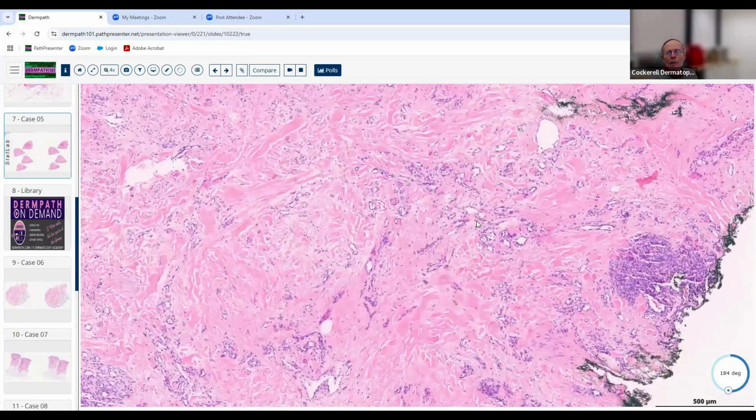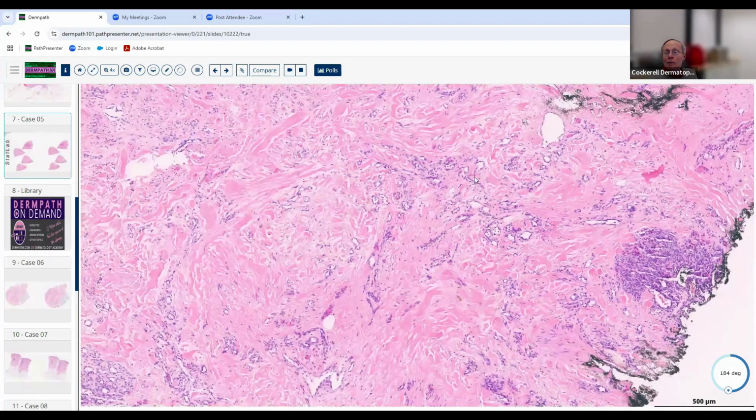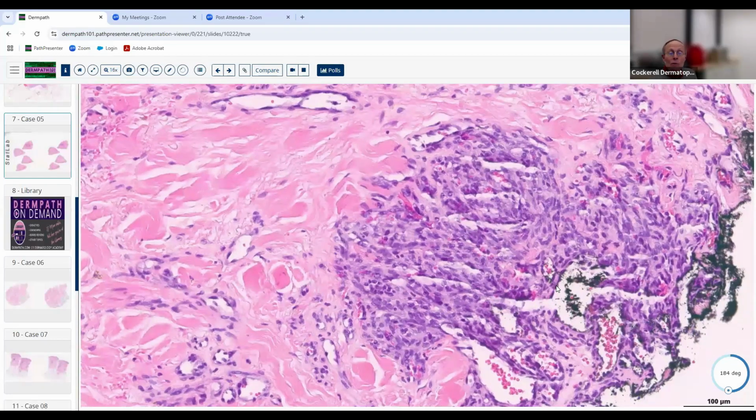It's a pseudosarcoma. I mean, it does have some histologic features that if you just looked at it in isolation, you might get kind of concerned about it. A lot of these blood vessels are somewhat irregular. They've got some slightly large endothelial cells. Don't see any mitotic figures. You've got this little sort of vascular tuft. We see that sort of tuft-like vascular proliferation sometimes in things like Kaposi sarcoma and whatnot. So when pathologists look at this, they start getting worried about it. But you need to understand this is basically just a reaction pattern that's seen in that setting.